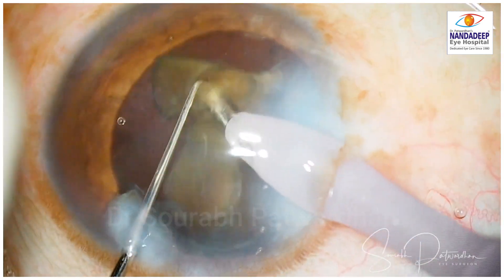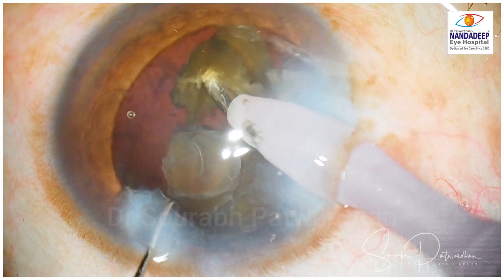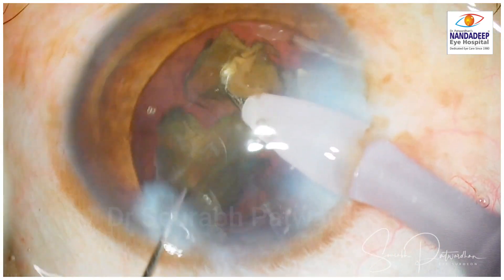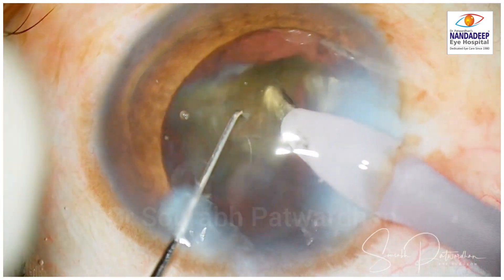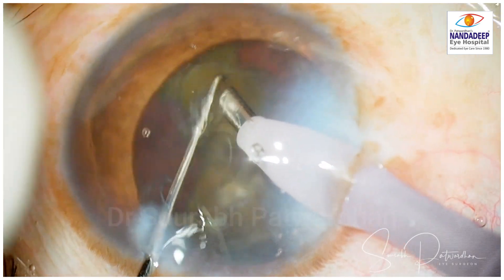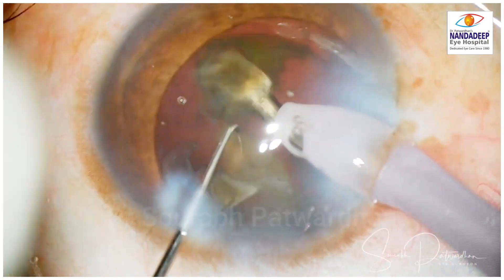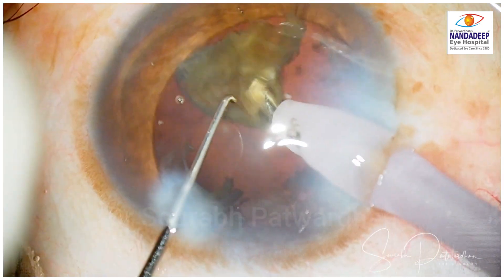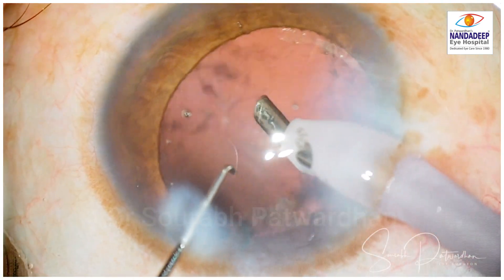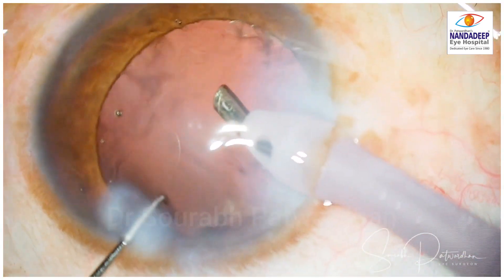Endothelium is well protected using a heavy dispersive agent — Hylucote — which is my agent of choice. We can also use Viscote. The chondroitin and hyaluronic acid combination gives very good protection for the endothelium. Make sure that no pieces are hitting the endothelium directly, and it should be well protected by the dispersive viscoelastic agent. Do not use cohesive agent for protection because it gets washed off very quickly.